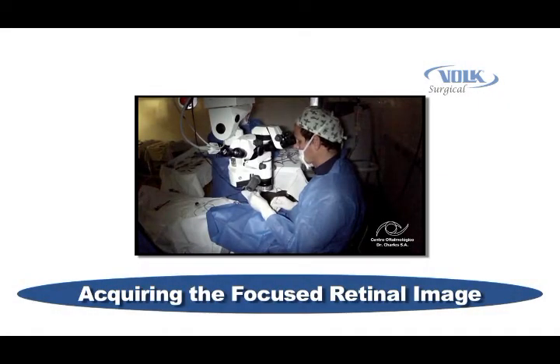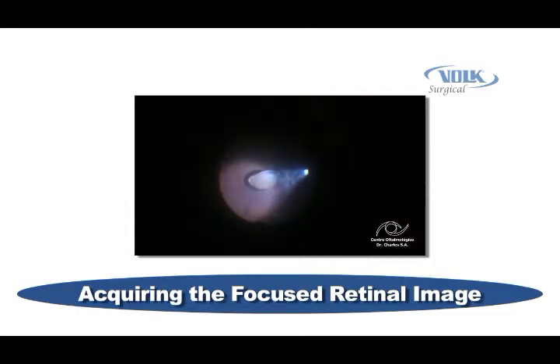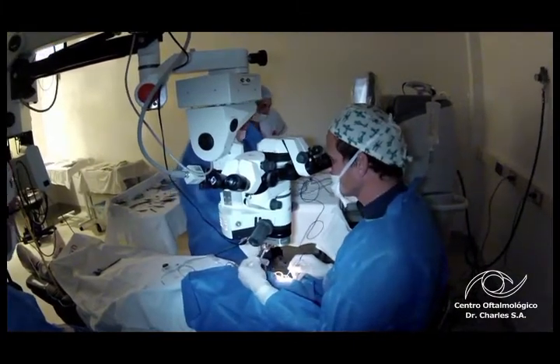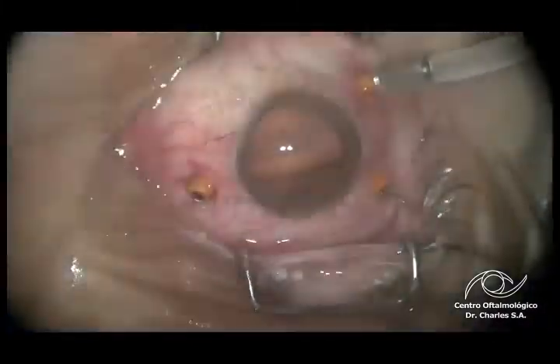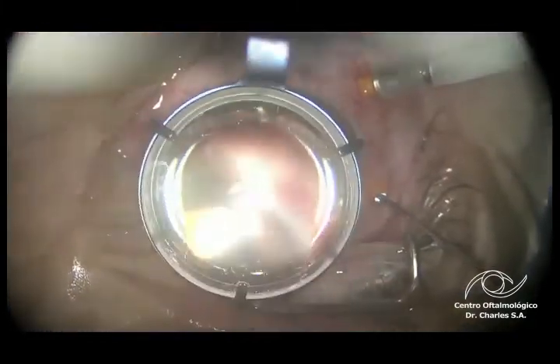This portion of the Merlin instructional video describes the method for acquiring a focused retinal image with the Merlin Surgical System. There are five simple steps involved in the initial setup for a focused retinal image. Once these steps are completed at the beginning of the case, you can simply switch the LPU between its up and down positions as needed with no further adjustment.